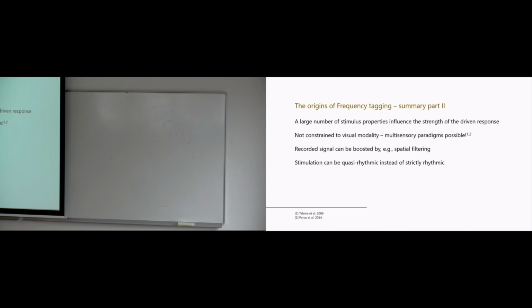That's a very good question. So I haven't put in any slides about that, but you're absolutely right. This is actually a direct consequence of the fact that the brain response that we drive is never sinusoidal and has a certain offset. So if you drive something at x hertz, you always see 2x, 3x, and so on responses in your spectrum too. And my approach so far has been that I've only looked at them if they are convenient. But you should actually take all of them into account, because when you think about the Fourier transform as the spectral representation of the signal, only all of them will allow you to reconstruct the whole signal, right? So it makes sense to look at all of them in concert.